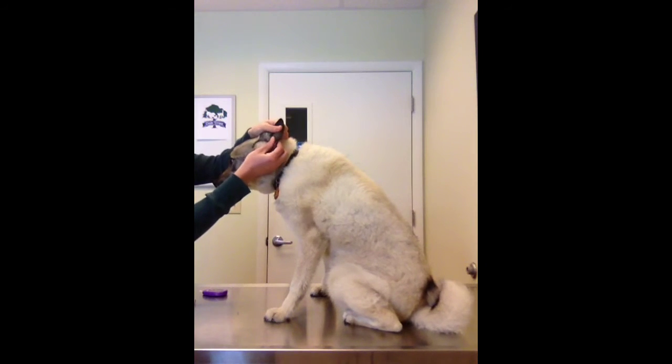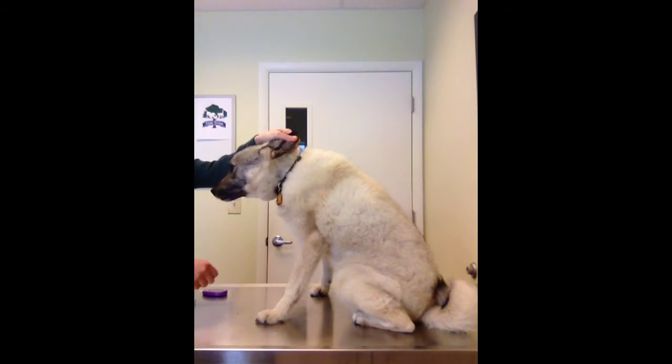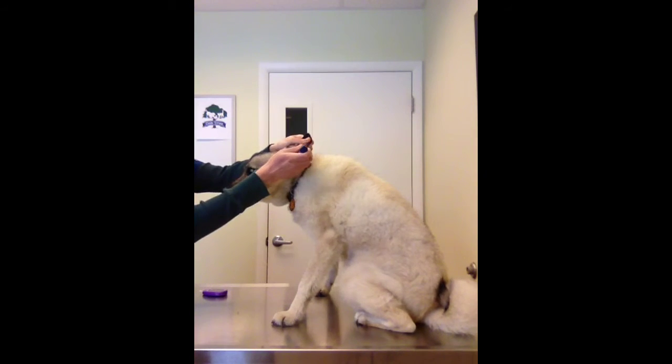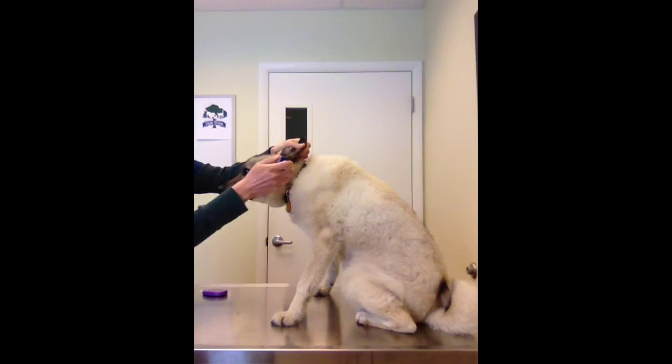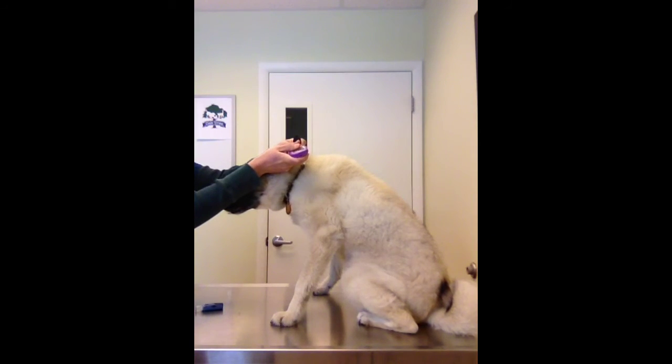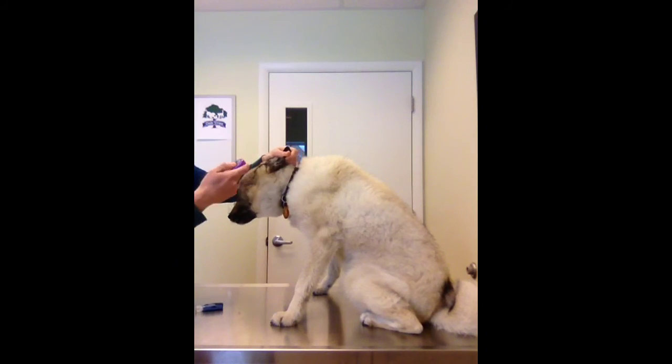So what we'll do is we'll just take the inside of her ear, make a small poke with our lancet, get our blood sugar sample, and then we have our reading.